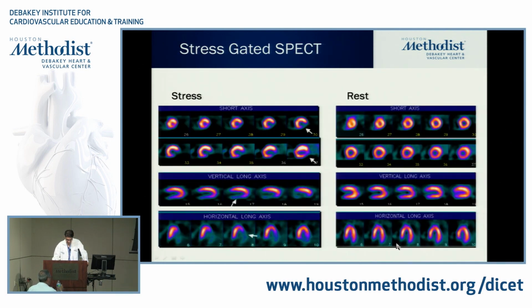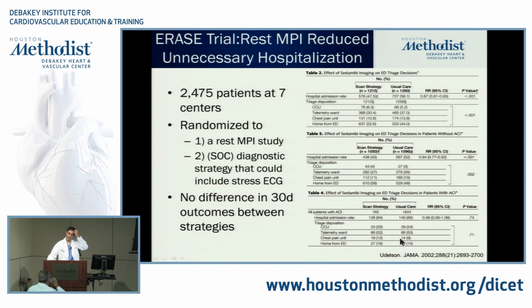So we're going to talk a little bit about SPECT, and there are actually two ways of doing SPECT. There's SPECT where the patient acutely presents, what we call resting perfusion, where you assess resting perfusion. This would be in the acute setting, where you have a patient admitted to your emergency room who's having active chest pain right then and there, and you want to know whether that is ischemia or not. Because if you remember the ischemic cascade, if they have active ischemia, one of the most sensitive things, the very earliest on the cascade, is perfusion abnormality.